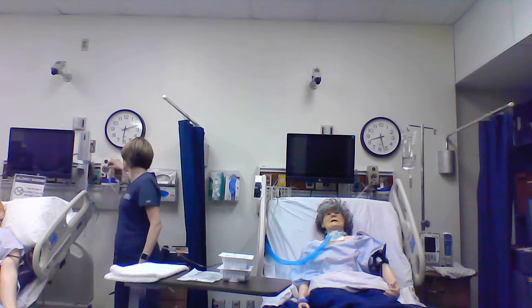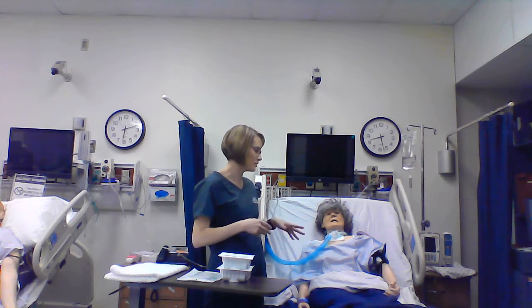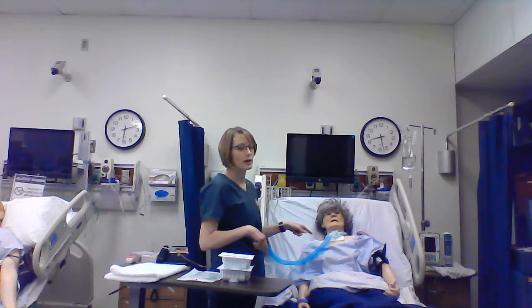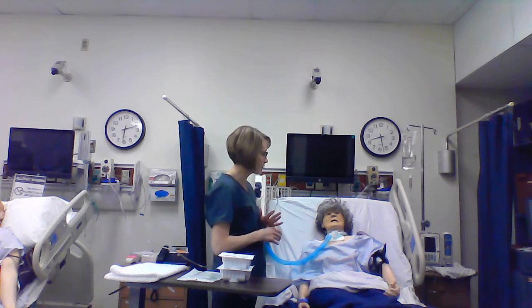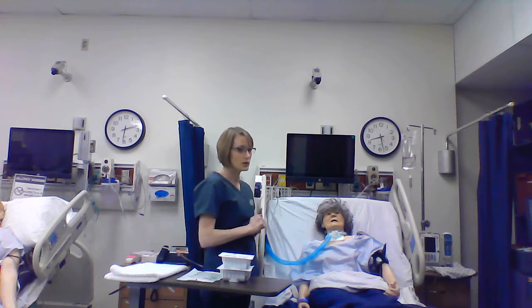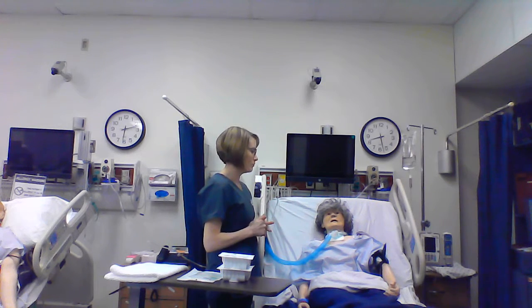I would go ahead and turn my suction on between 80 and 120, and then let her know that she needs to take 3 to 5 deep breaths to hyperoxygenate her, because I'm going to remove this oxygen from her tracheostomy while I perform care. I also want to make sure that she has a way to communicate with me. So I'm going to have her raise her left hand if at any time she feels like she needs a break. If she's in any distress or pain, to let me know that she needs to stop for a minute. And then we can resume whenever she's comfortable.